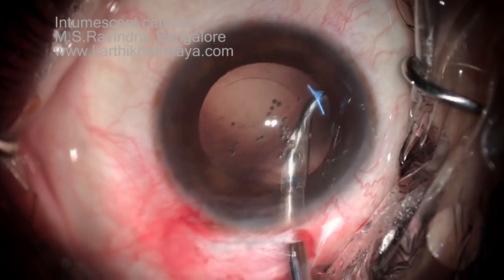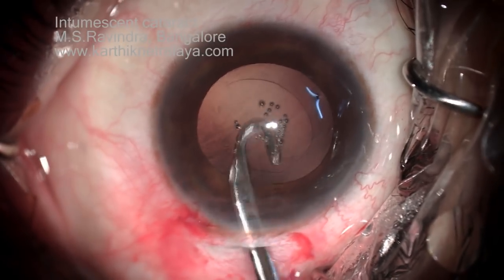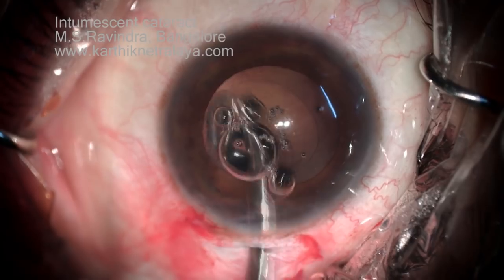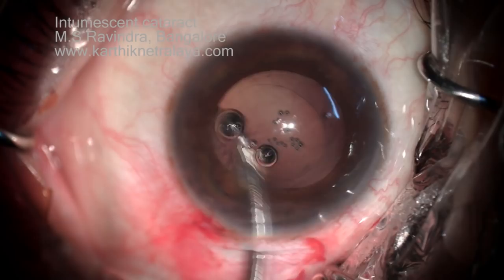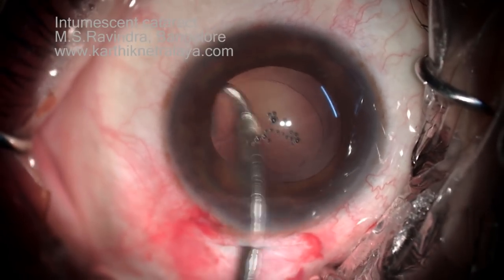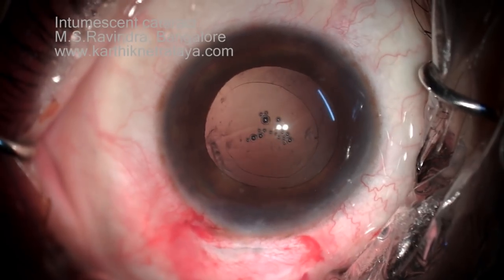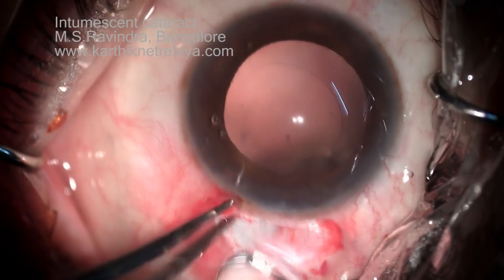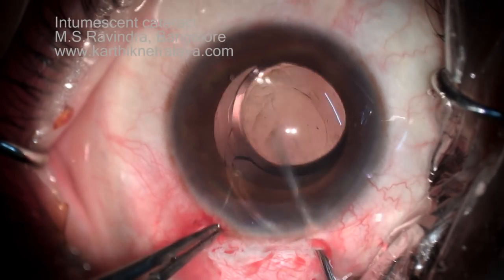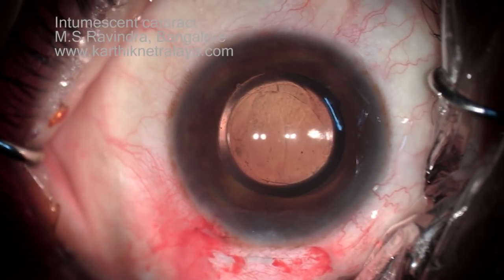Polish the anterior capsule and evacuate the lens epithelial cells as much as possible. There is no superior rectus suture — it's not necessary at all for this technique, and there is no need for any peribulbar injection. This facilitates decreased orbital pressure, and the posterior pressure is generally not seen in these patients if nothing has been injected into the orbit. Some scarification of the capsular bag is noted, so massage the posterior capsule to remove capsular debris. The IOL is implanted in the capsular bag very easily without folding it so that the architecture of the lens is maintained. The haptic-optic junction is aligned to the 3 and 9 o'clock position to minimize dysphotopsia.